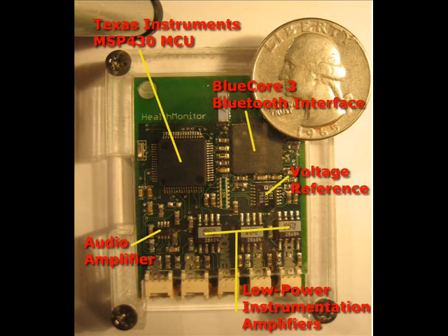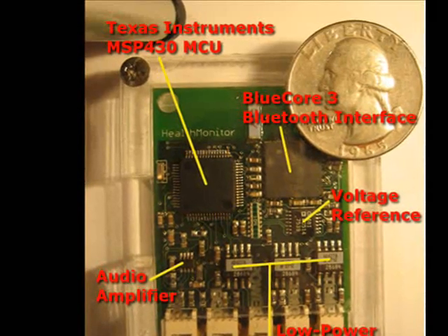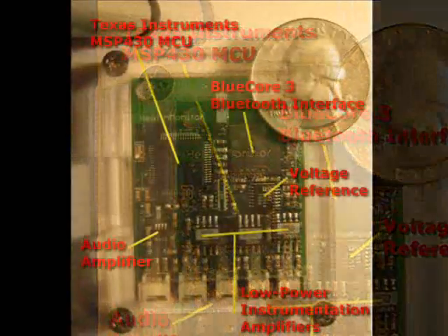First, the device anatomy. At the core of the device you'll find a Texas Instruments MSP430-based microcontroller. This microcontroller provides analog to digital conversion, interfaces with the flash-based file system, and the Bluetooth chipset.